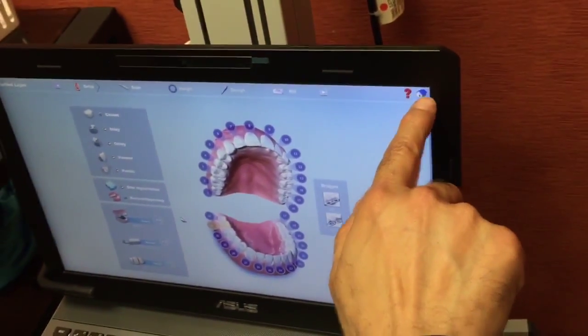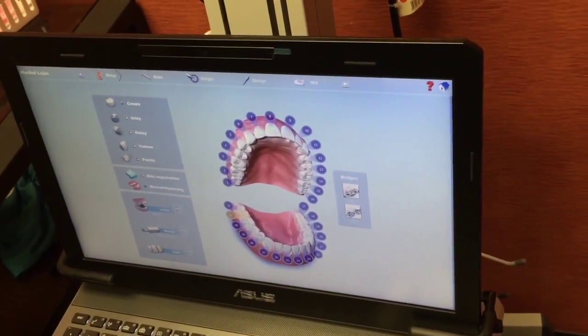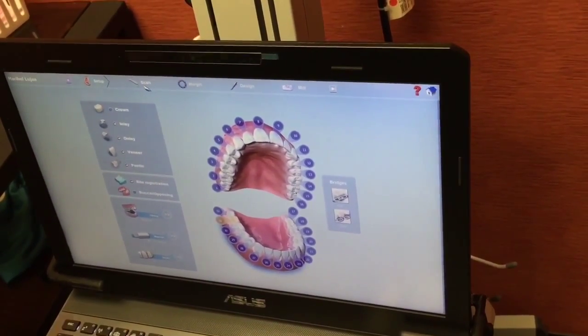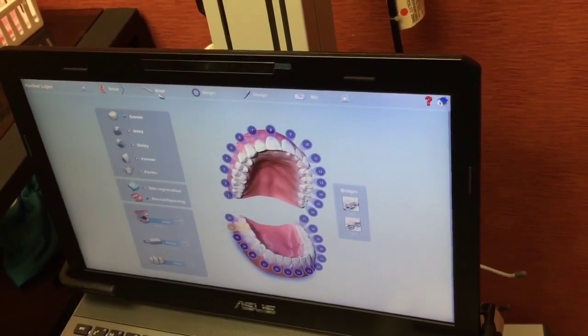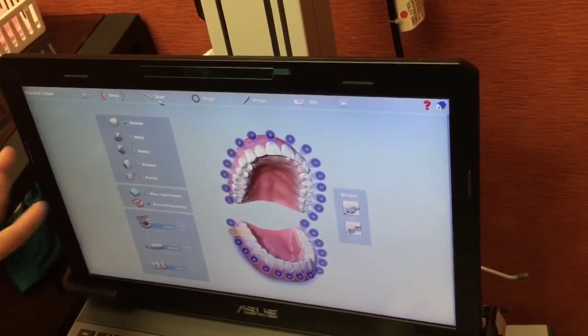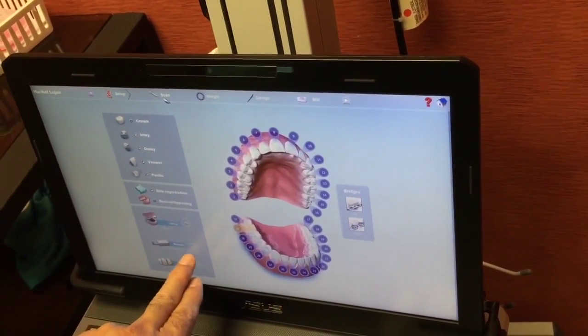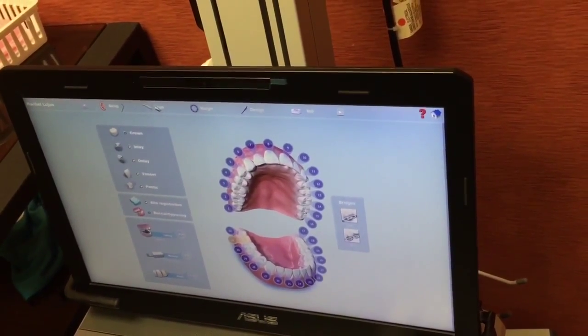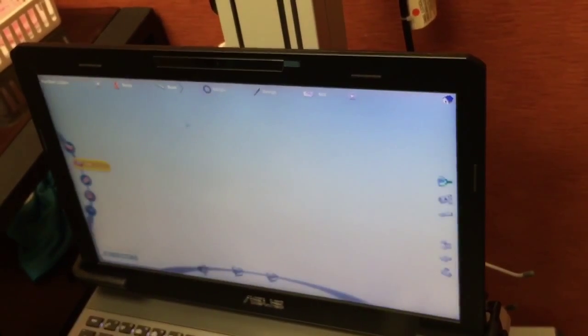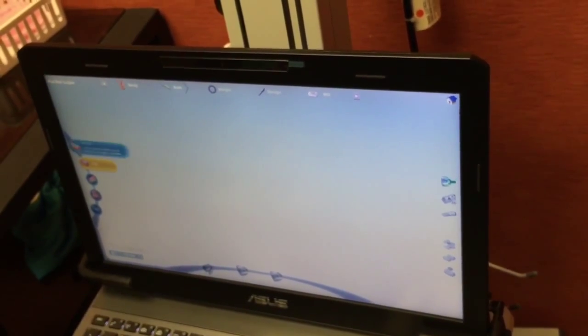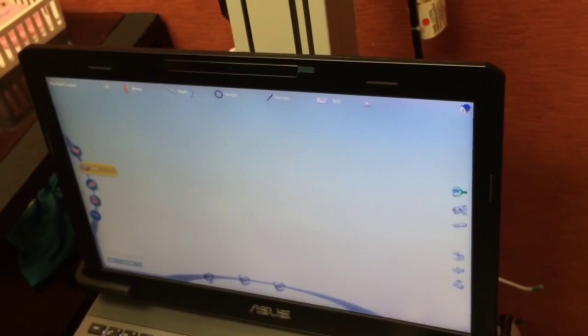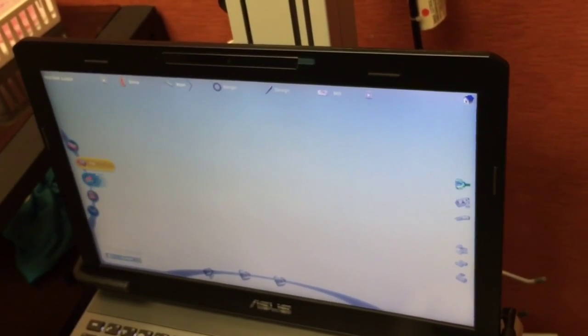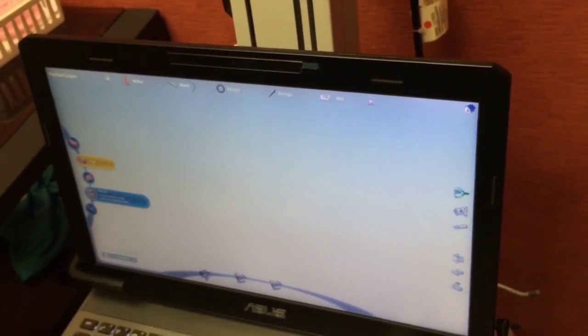This is home if you want to go back to your main menu. So we're going to go to the scan tab right now. Because I've already entered the data. I've got a patient's name. It's going to be a crown on 31. It's going to be a library A tooth form. And we're going to use an Emax block. And it's going to be a shade A2. So we're going to go to the scan tab. Here are the icons. You have a pre-op model, prep model. This is opposing. See, you just click on everything. Buccal is when you do the bite.